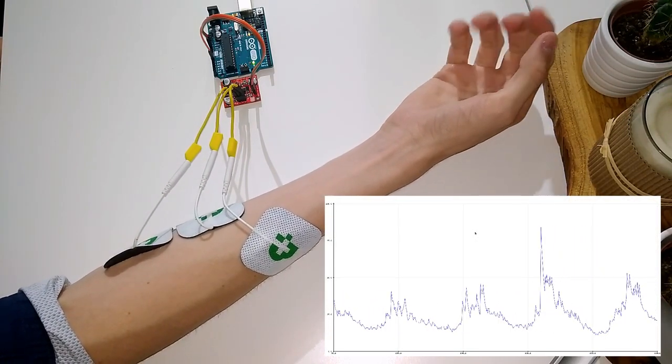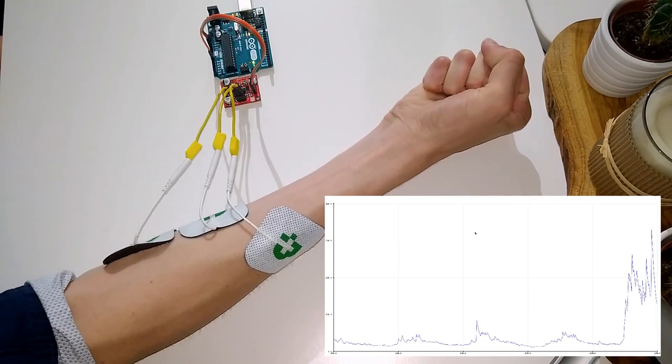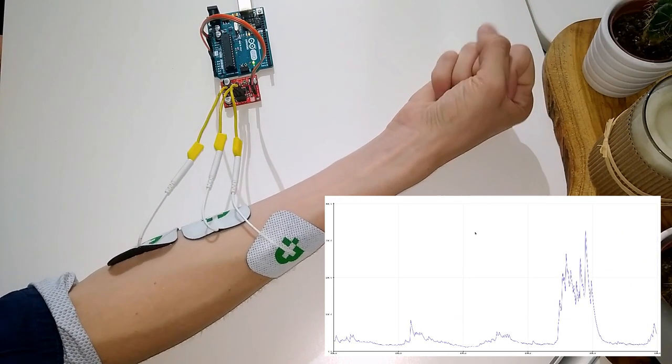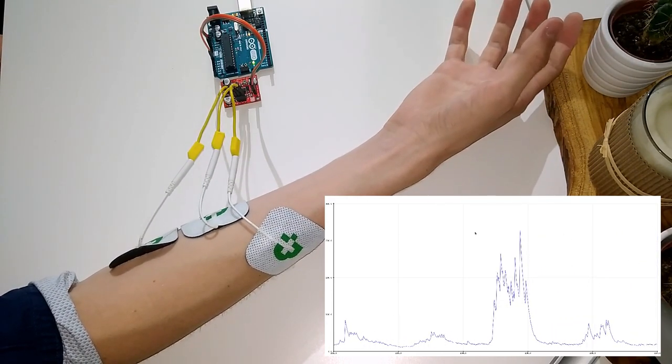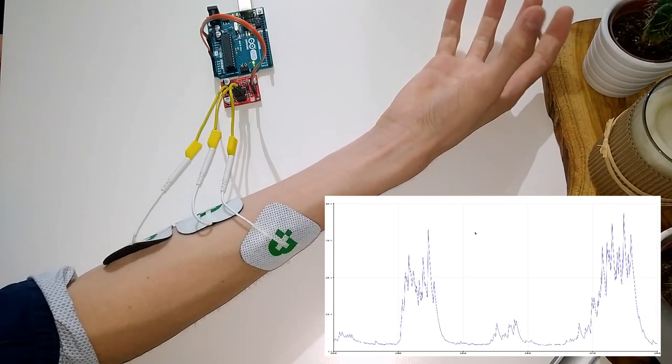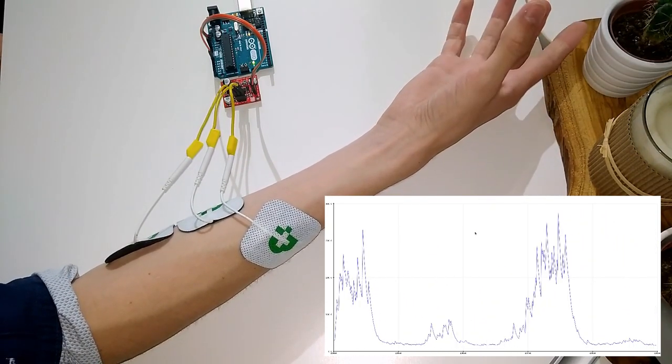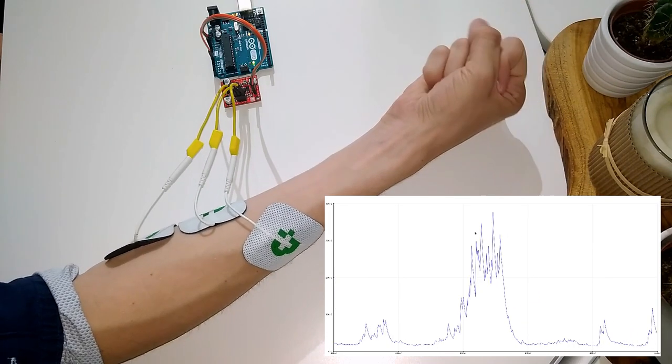The voltage is proportional to the muscle activity. A potentiometer can be used to set the sensitivity, which also depends on the placement of the electrodes.